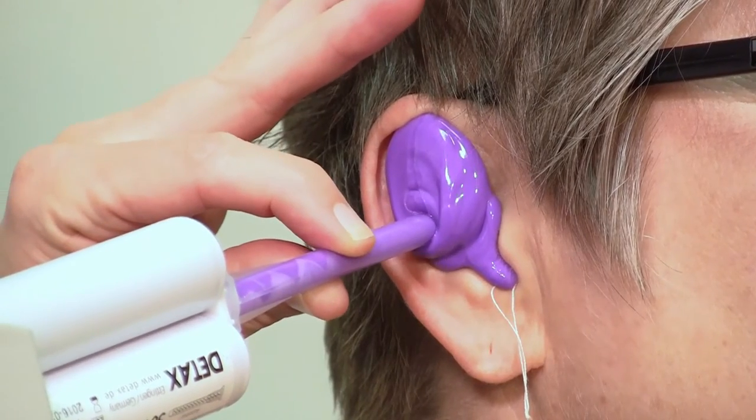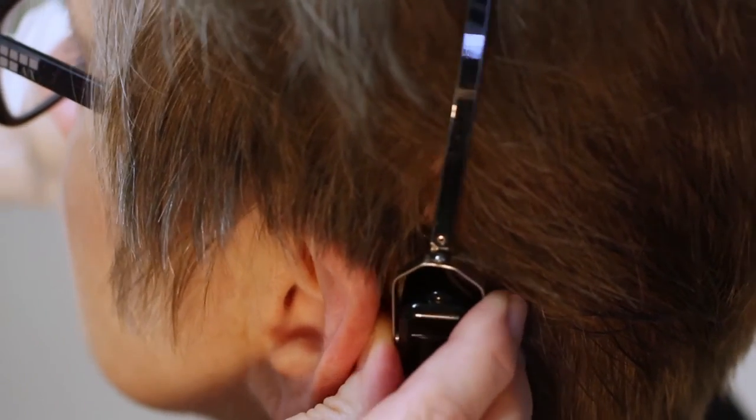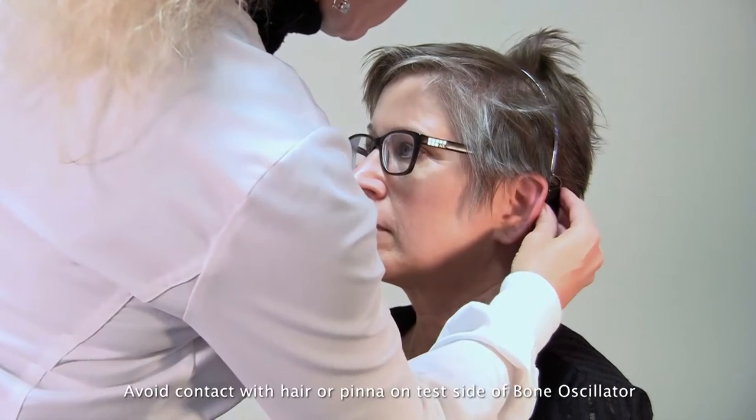Keeping the tip embedded. Taking care to protect the ear from the clip holding the bone oscillator, and once I've got it placed securely, I'll bring my headband forward slightly.